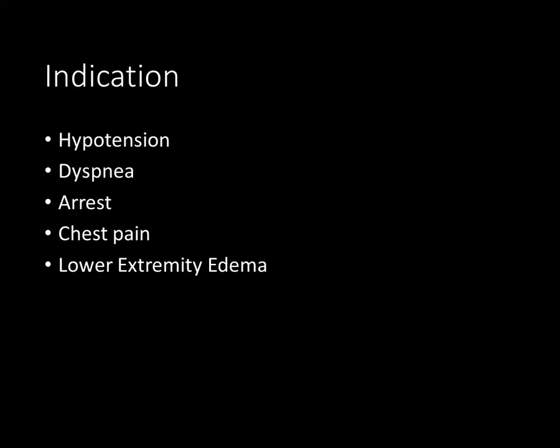As with any ultrasound exam, we must discuss the indications, the acquisition, the interpretation, and medical decision making. For the purposes of this lecture, we will be discussing physician-performed focused bedside ultrasound. This is different than a comprehensive echocardiogram ordered by a physician and acquired by either a cardiologist or a sonographer. The indications for bedside physician-performed ultrasound for cardiac are hypotension, dyspnea, cardiac arrest, chest pain, and lower extremity edema.